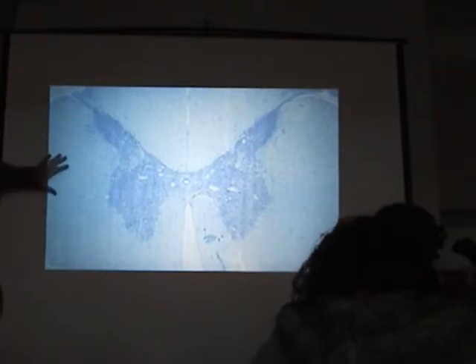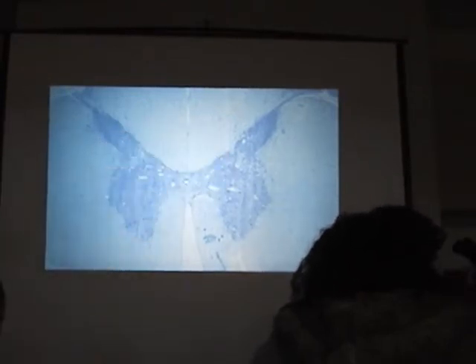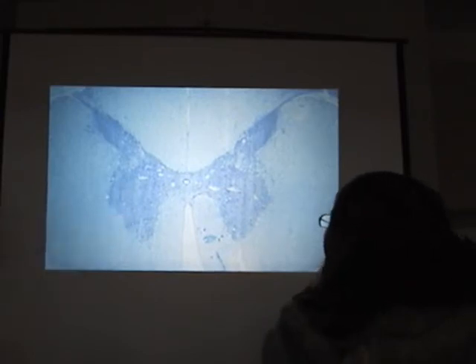All right? So white matter, white matter, white matter. So it's opposite what you see in the brain, where the gray matter is external. All right? Are there any cell bodies in the dorsal horn? Yes, there are. They're smaller neurons, and if you look closely and are well fixed, then you can pick them out. What's nice about the ventral horn neurons is they're large. They kind of hit you upside the head.